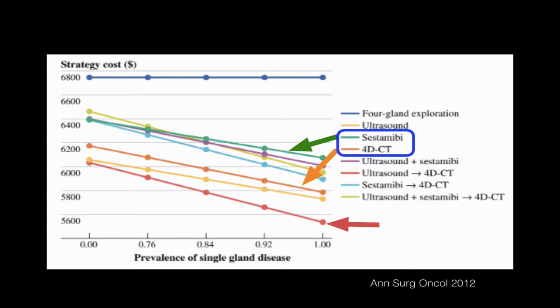The least expensive strategy was actually to do an ultrasound first and then proceed to 4D-CT if the ultrasound was negative.